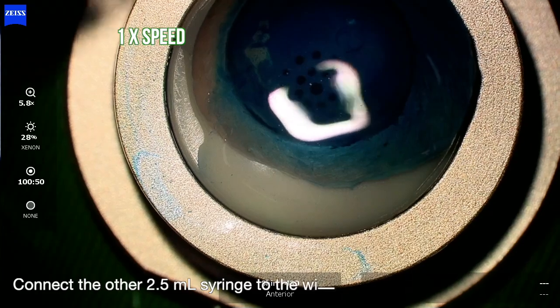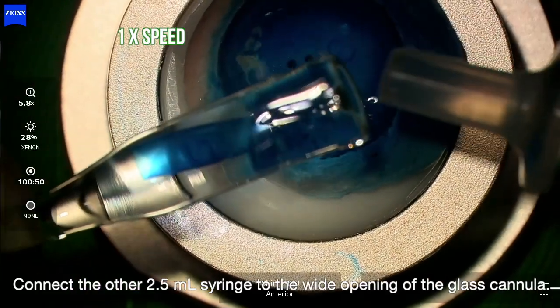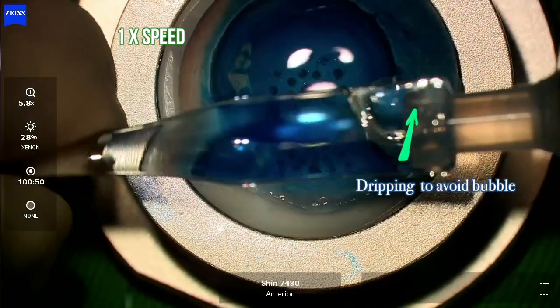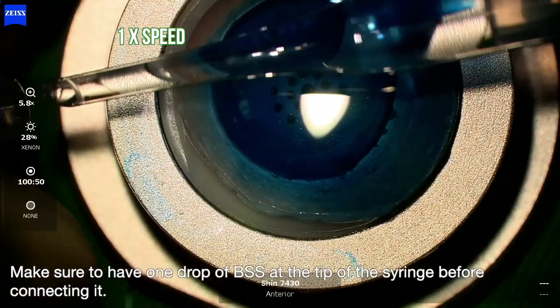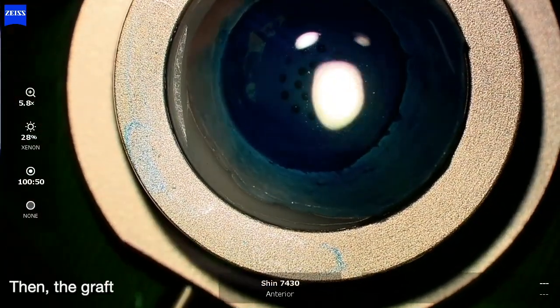Connect the other 2.5 ml syringe to the wide opening of the glass cannula. Make sure to have 1 drop of BSS at the tip of the syringe before connecting it. Then the graft is ready.